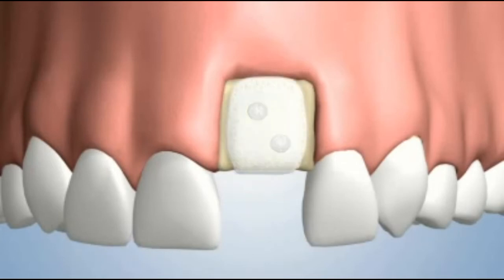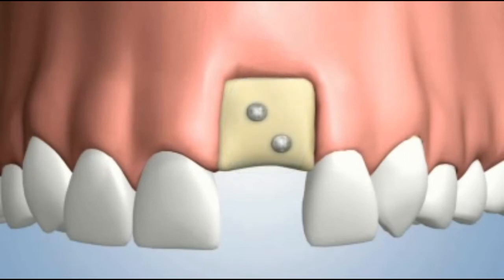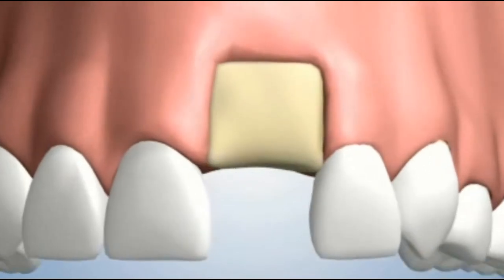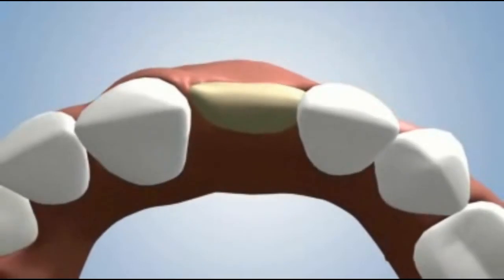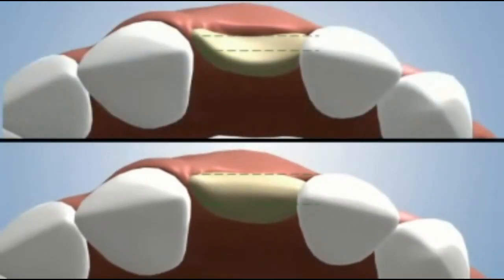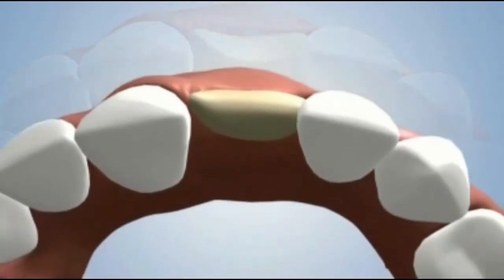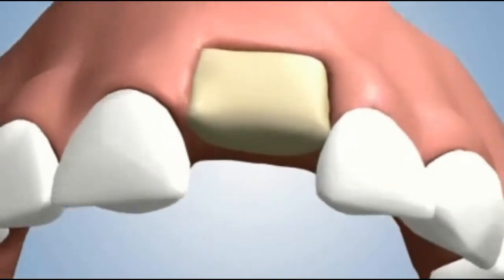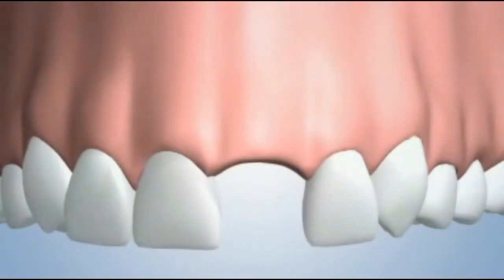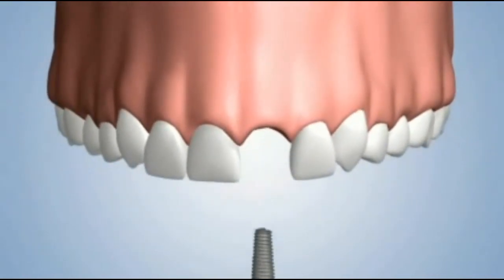A specialized membrane is then placed over the site to improve healing. When the bone has successfully matured, the titanium screws are removed. This type of bone grafting can restore severe cases of bone loss, making it possible to successfully place dental implants and enjoy the benefits of secure replacement teeth.